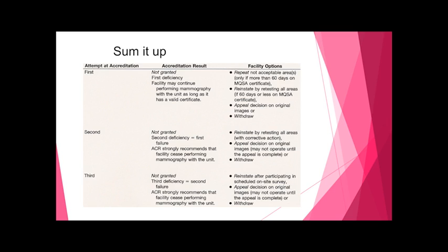They start sending out the SOSS team, the on-site team, where they comb through your records, the technologist records, the radiologist records, the medical physicist records, and they're like, what is your problem? Why can you not pass 3 times? And they really take a serious look at you and see what type of retraining you need, and send you to classes too.